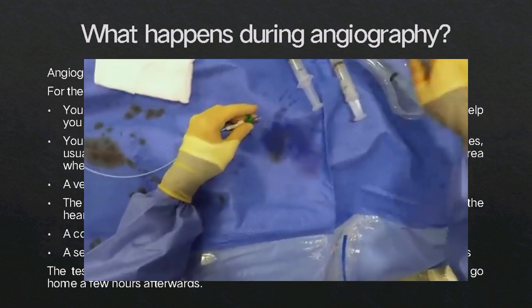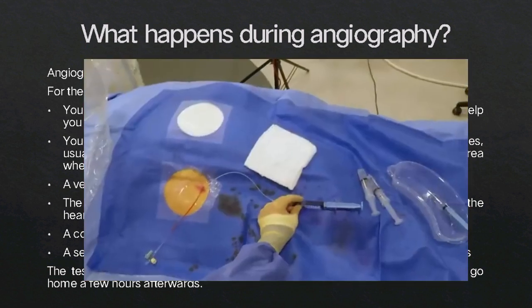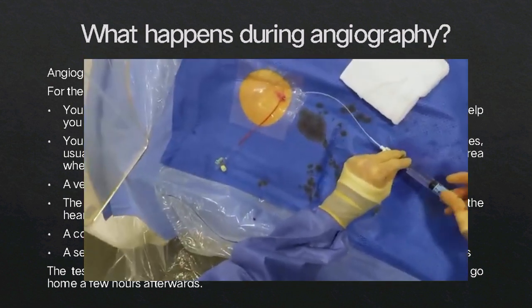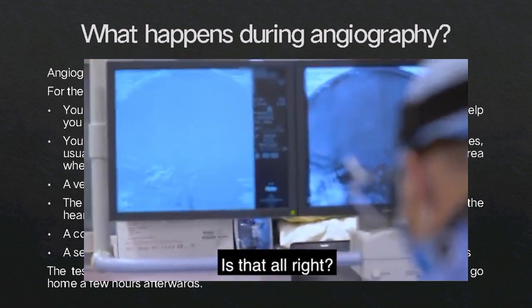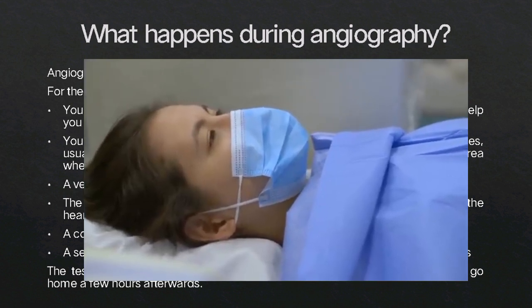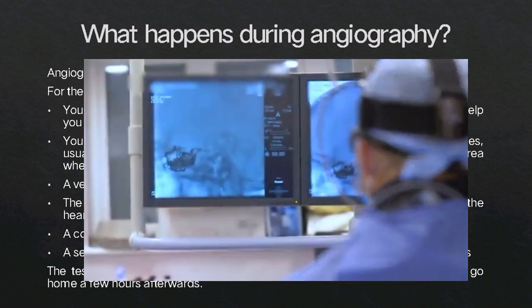Angiography procedures can range in time from less than 30 minutes to 2 hours or more. It is important that you relax and remain as still as possible during the examination. The radiologic technologist and radiologist will stay in the room with you throughout the procedure. If you experience any difficulty, let them know. You'll usually be able to go home a few hours afterwards.